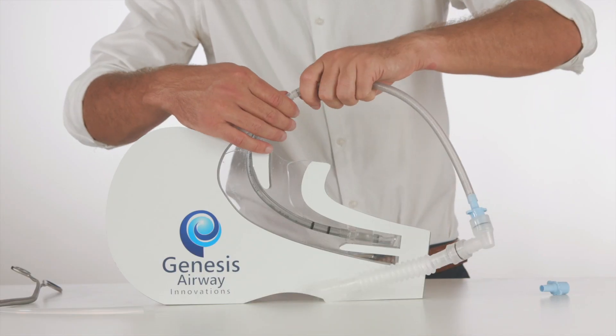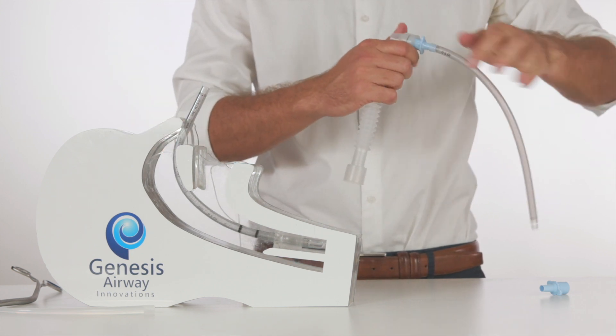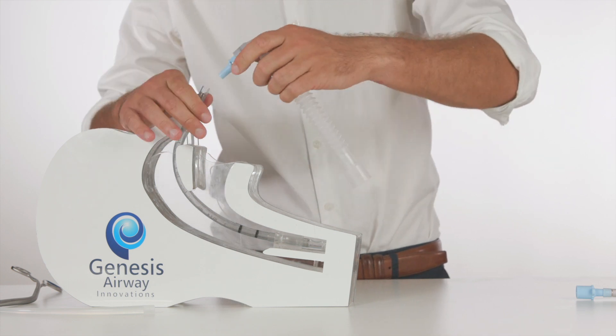The tubing is disconnected, and the 15mm connector from the ETT is replaced onto the endotracheal tube. The patient can once again be ventilated.